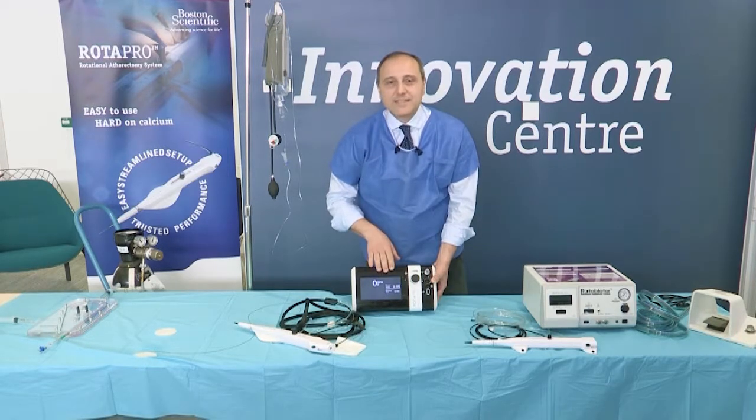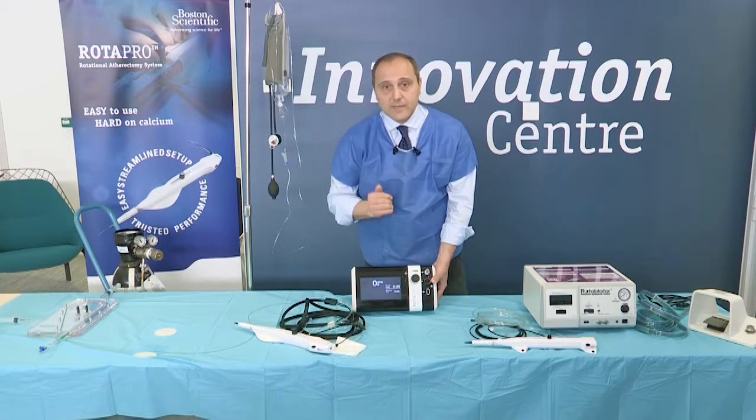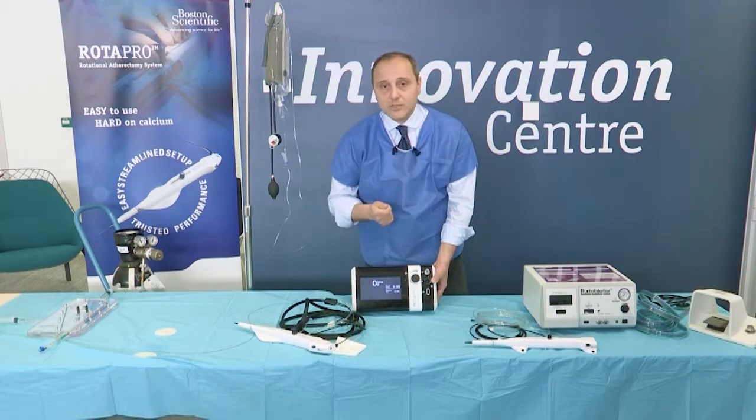Last but not least, a visual colored signal will pop up during the procedure, informing the operator how the speed of the rotational atherectomy is decelerating. This is very key information for an operator, who in this way is informed of the possible risk of burr trapping or lodging within the coronary artery.